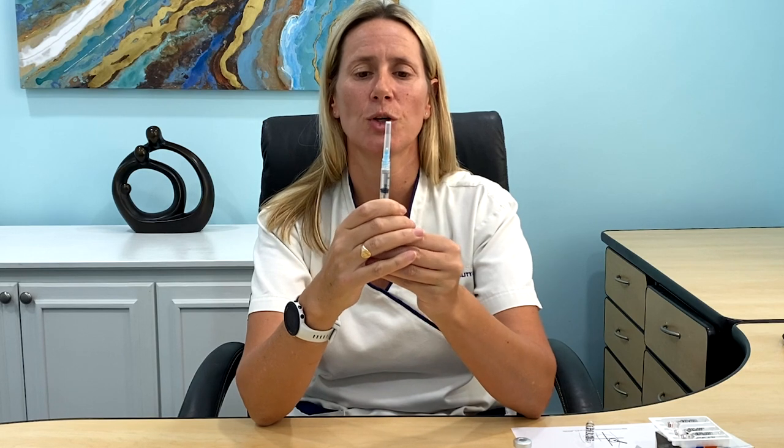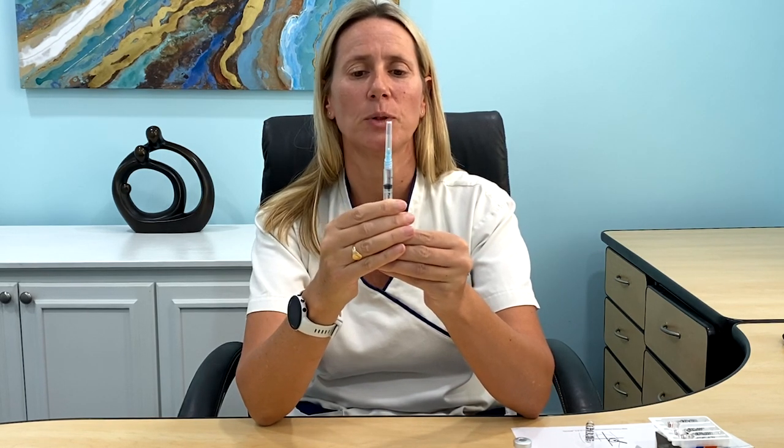Once you have your 1ml in your syringe, recap your needle, twist it off, and replace it with your smaller needle, which is the one for the actual injection. Then push your air out — tap it in case there's any air — and push your air out until you see a drop of medication at the needle tip. You're now ready to administer the intramuscular injection.